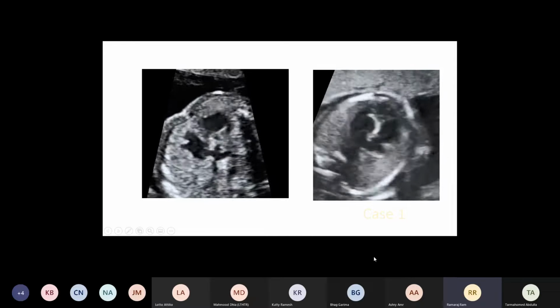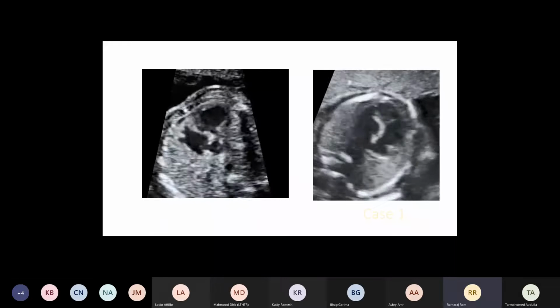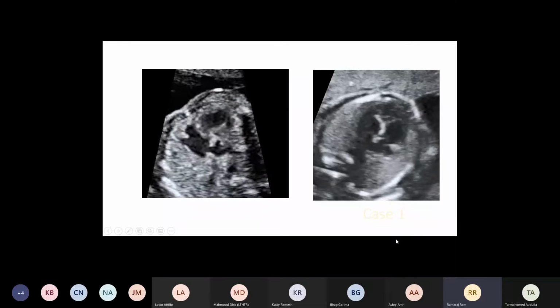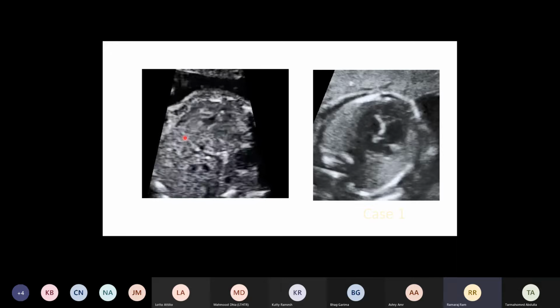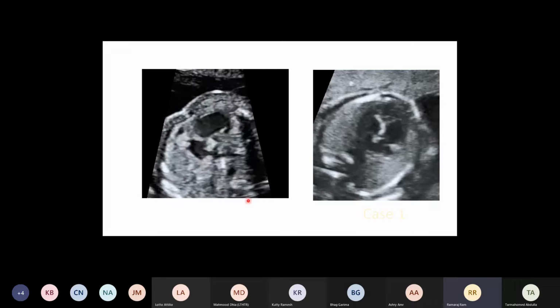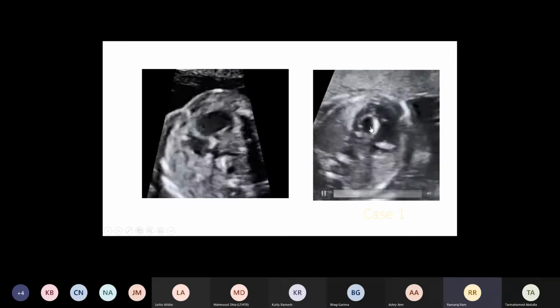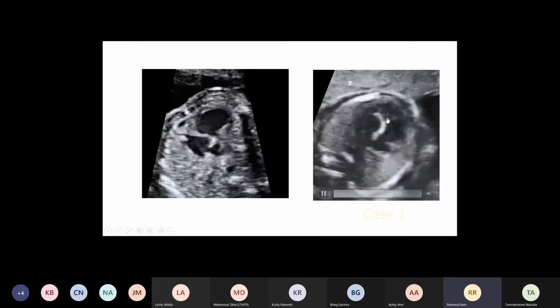So here in this example, you could see posterior spine, posterior abdominal aorta. Then you're seeing the pulmonary veins connecting to the left atrium, if you can point out, Abdullah, and there is an atrial septum. And you see the right heart, which is the anterior structure, is normally developed. However, the left heart, the LV, is small. So this is your hypoplastic left heart. And again, another example of your hypoplastic left heart with the EFE and a foreshortened LV apex.